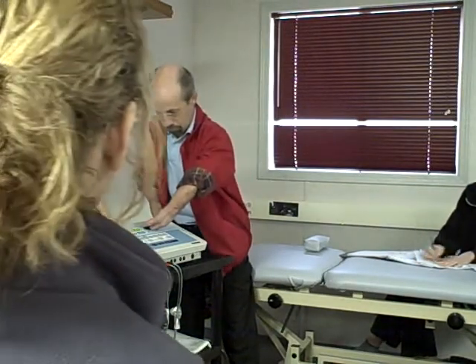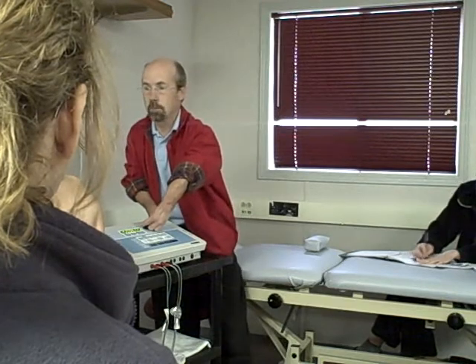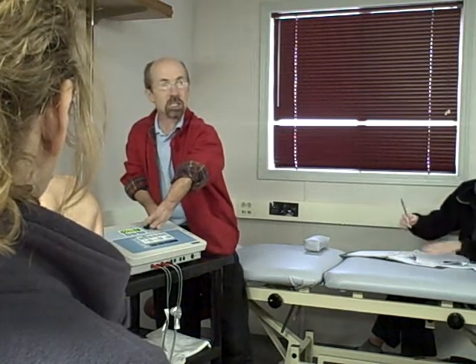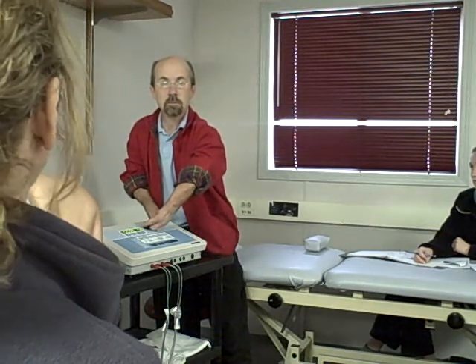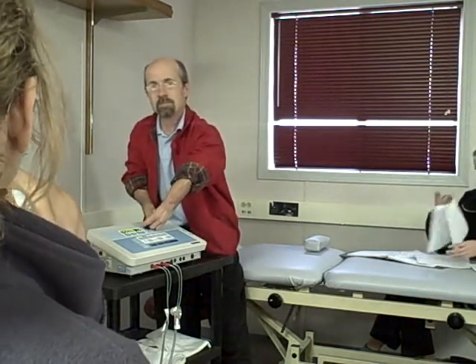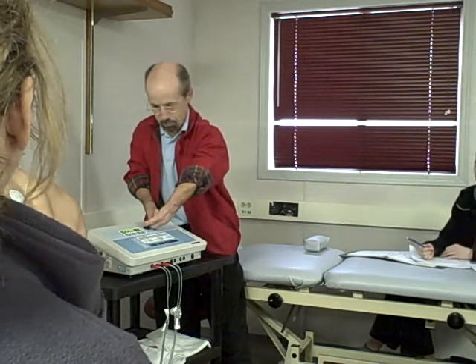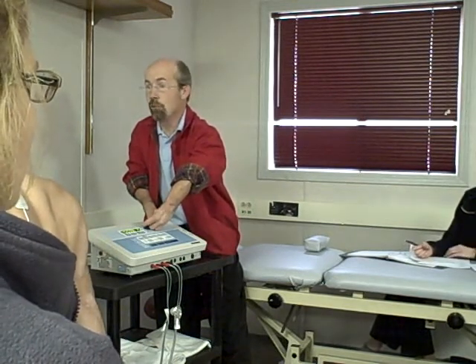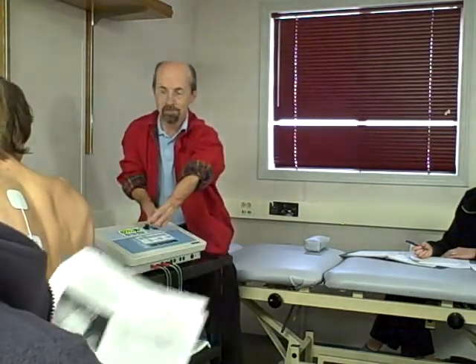The waveforms in this little box are designed to reduce pain. So basically, you just slowly start going up until the patient gives you some feedback, some relief from it. Now, of course, this leads to something else. You would never hook anybody up if you feel like there's a communication problem. I'm not just talking about a language barrier, because even if you speak a different language, they can tell you: is he feeling it, and how much, and what's the time between feeling it and not feeling it? Well, it depends, everybody's different. They usually feel a tingle. It'll go to a fast vibration. You do feel it, right? Okay, I'm sorry, this is what I need to hear. So let's stop for a second. Your patient can't tolerate.